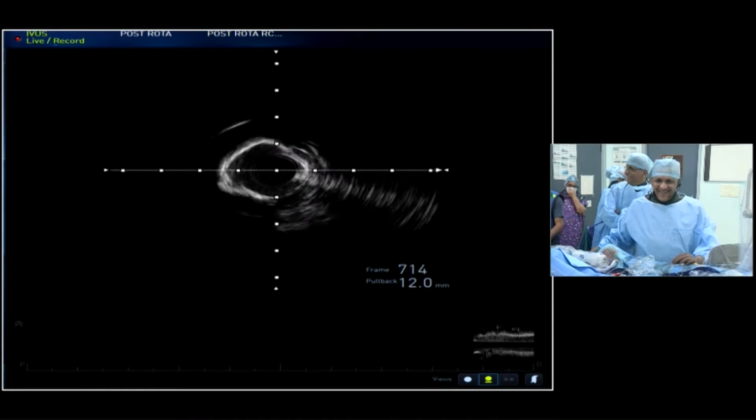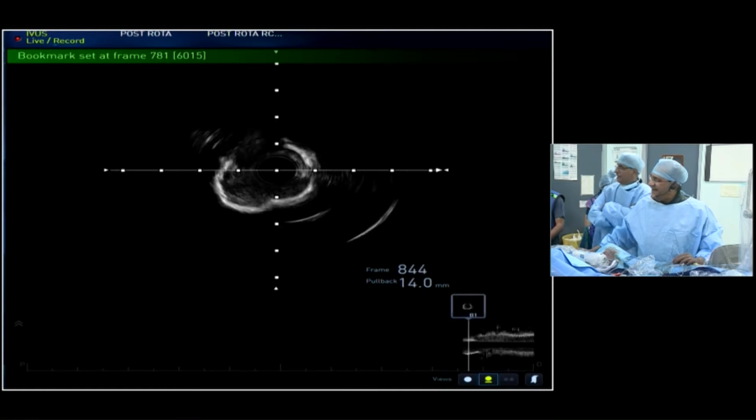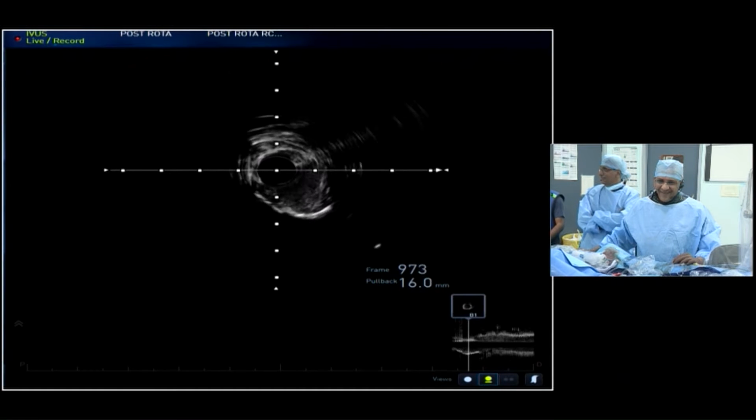There you go. There's that one area. Look at that calcium. Look at this. But if they just replace the old one with the new one without charging much, it's welcome. Yeah, but they don't do that.